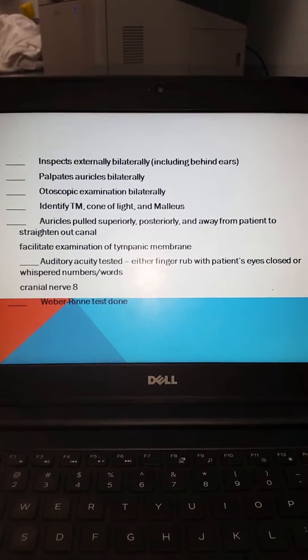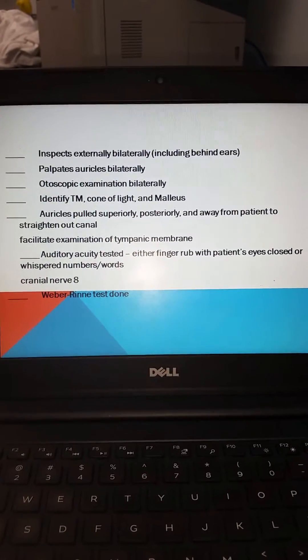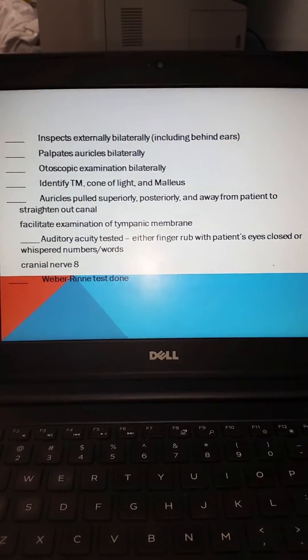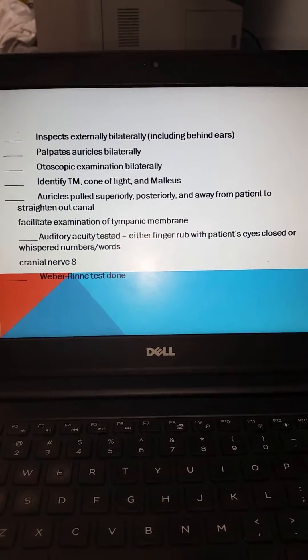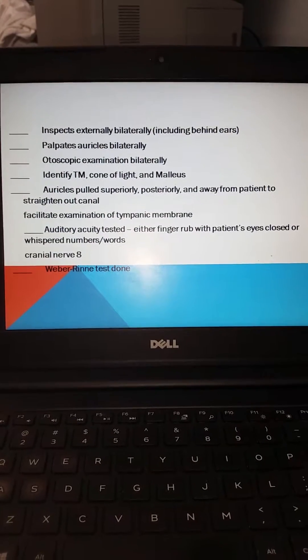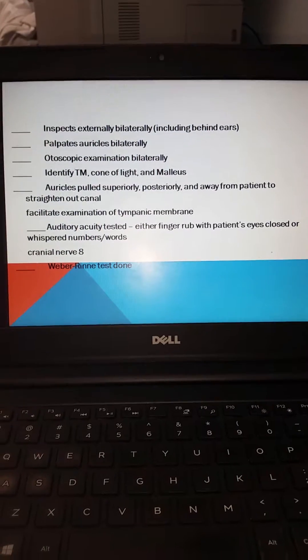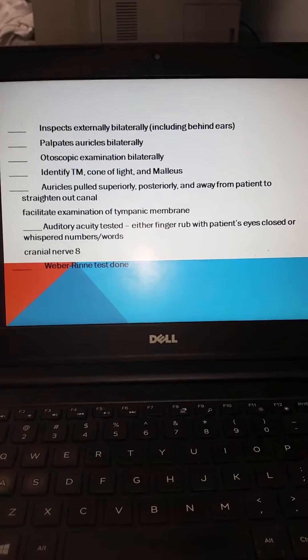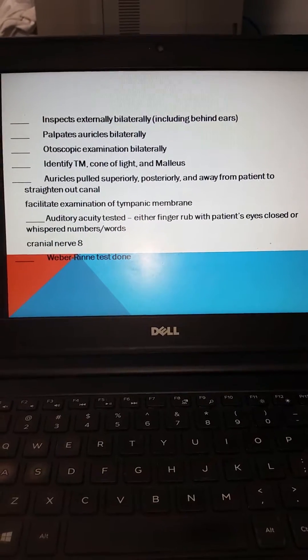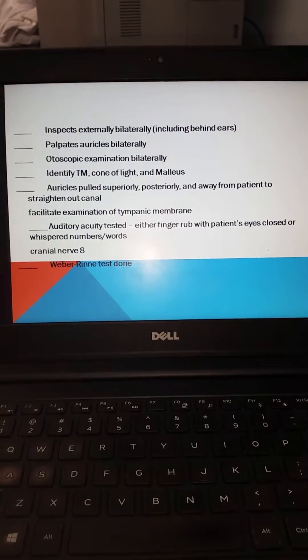The skill sheet provided for you discusses inspection of the external ear bilaterally, including behind the ears, palpation of the auricles bilaterally, and otoscopic examination bilaterally with identification of landmarks on the tympanic membrane, the cone of light, and the malleus. While doing the examination, remember that in the adult patient you're going to pull the auricle posteriorly, superiorly, and away from the patient to straighten the external canal. This will facilitate your examination of the tympanic membrane.